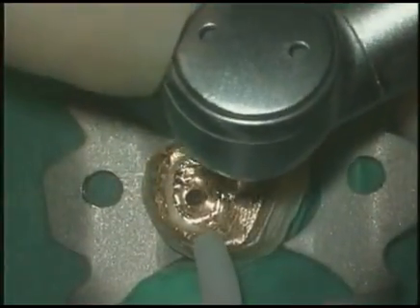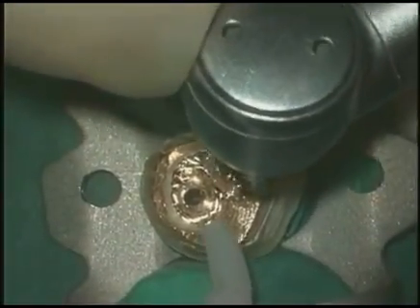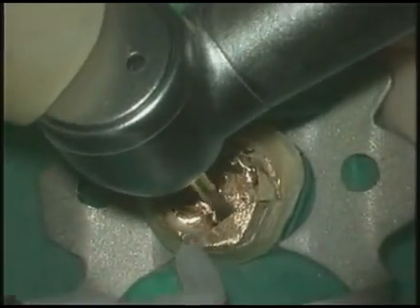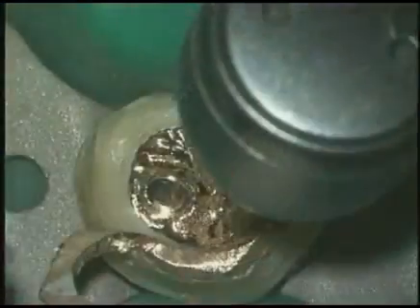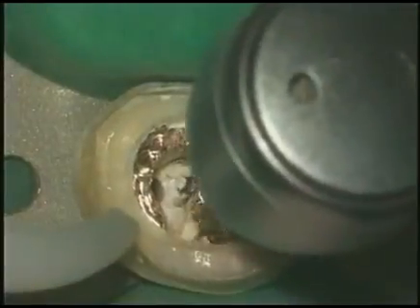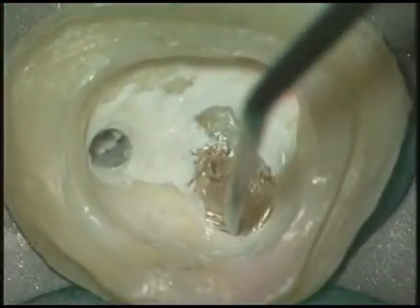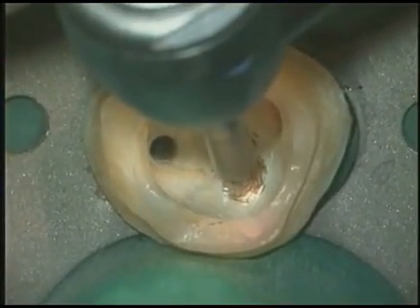Now we need to progressively remove more of the core to free up the post in the distal buccal. Learn to simplify. Section buccal to lingual to divide the core into mesial distal halves. This not only improves vision and access for the burr, but it will facilitate ultimately the safe removal so that we maximize remaining tooth structure. Learn to brush cut and keep the burrs off the pulpal floor. Let's keep our burrs off this area because it would be easy to inadvertently perforate the furcal floor.